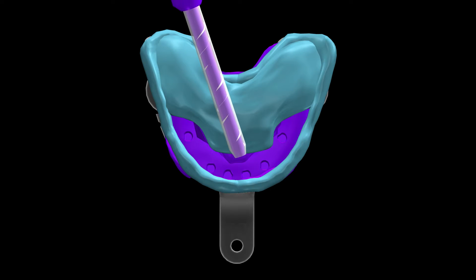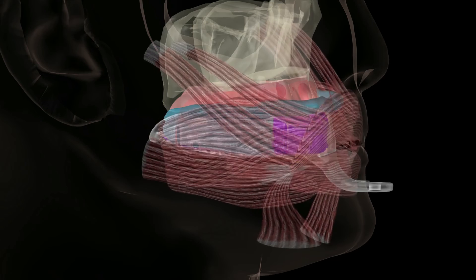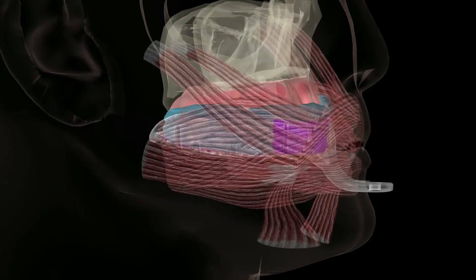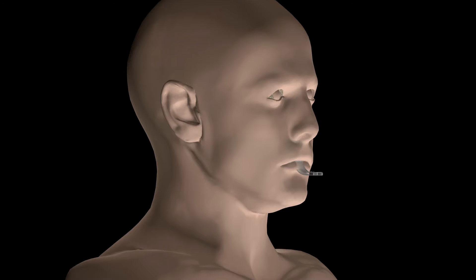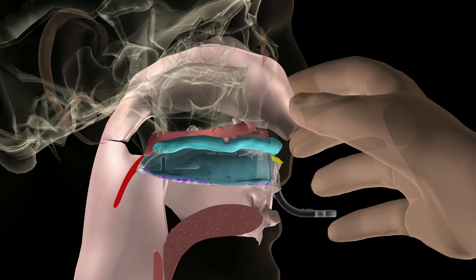Now, apply the rigid PVS into the tray over the implant coping locations. Then, place back into the mouth and have the patient repeat functional border molding, including the post-palatal area with the patient coughing while occluding their nostrils.